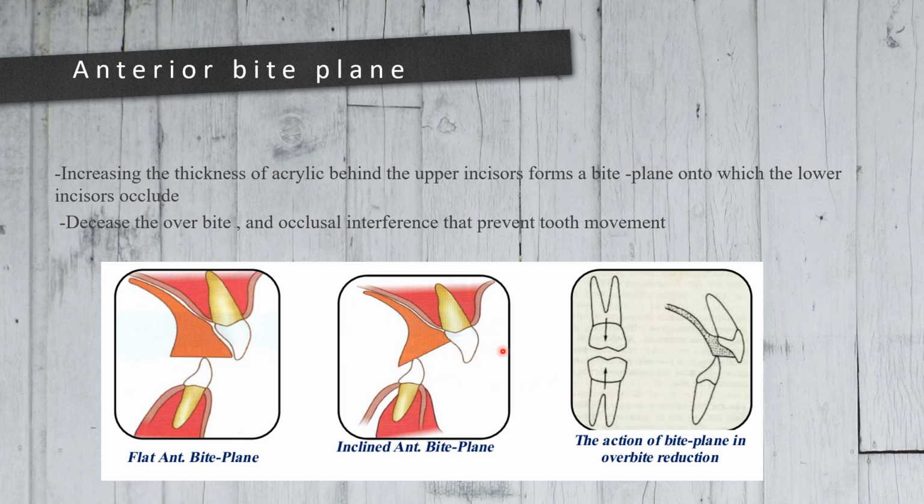So the anterior bite plane is used in the treatment of deep overbite.